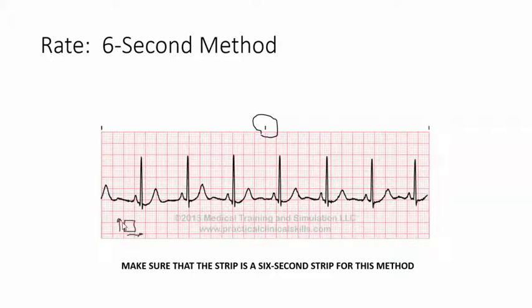Okay, and then each large square, remember the time in seconds is 0.2 and the amplitude is 5 millimeters. Okay, so what you're going to do is you're just going to count the number of R waves. Remember this is QRS. This is the R wave. You're just going to count the number of them. So we have 1, 2, 3, 4, 5, 6, 7. So the heart rate is 70 beats per minute.